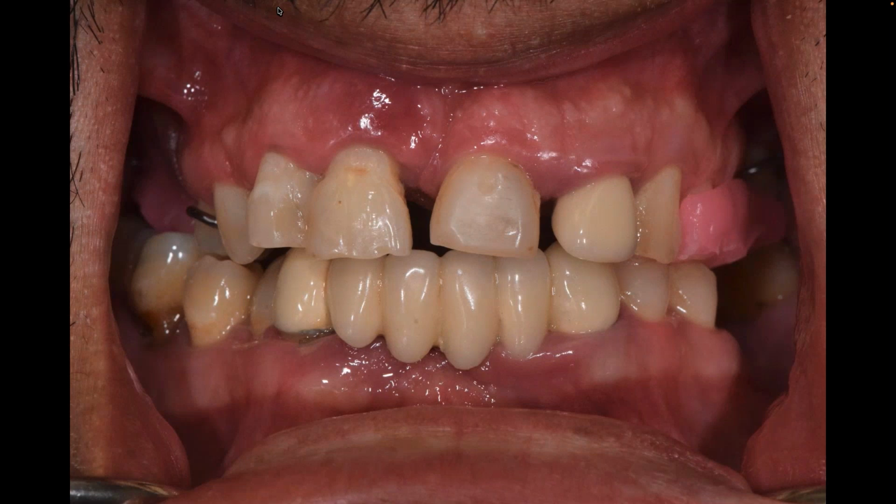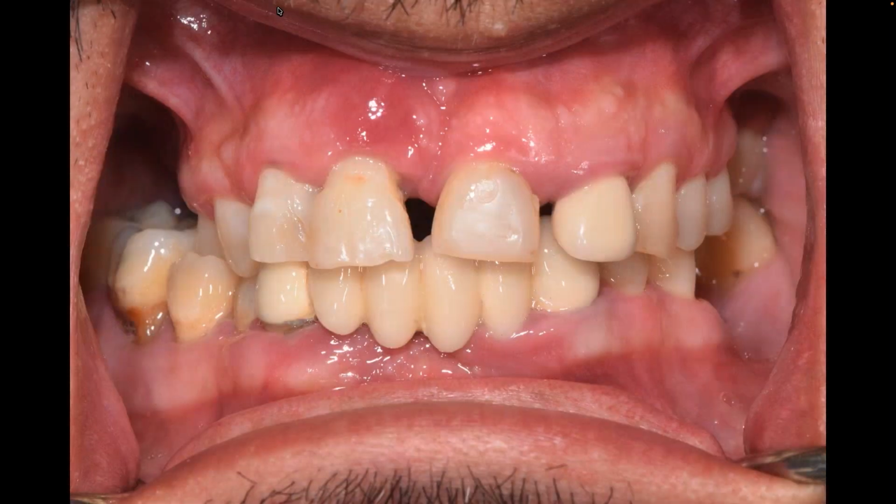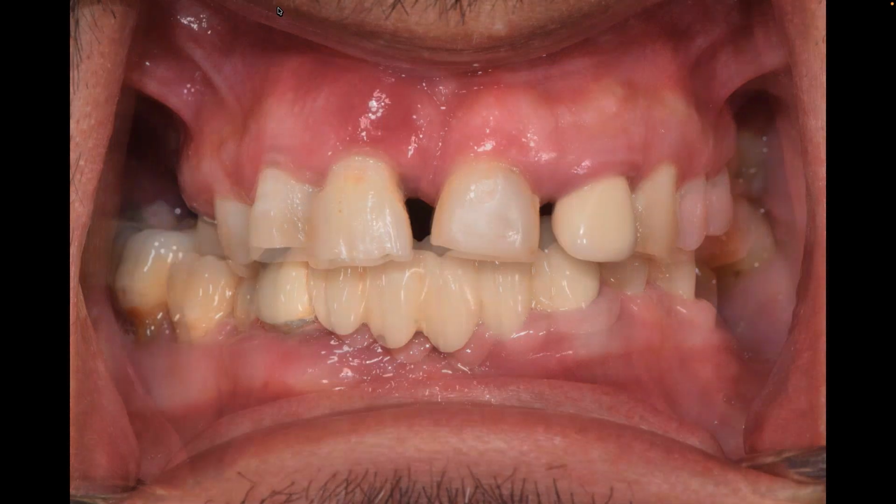I know that this picture might be a little deceptive, but please take my word for it. The teeth are apart. The teeth are not touching. If I show another view, which I don't have in this presentation, you'll see that the CR is actually recorded at an open vertical, because as soon as the teeth touch, guess what? The patient will go like this. We'll go into MIP. We'll go with the shift.